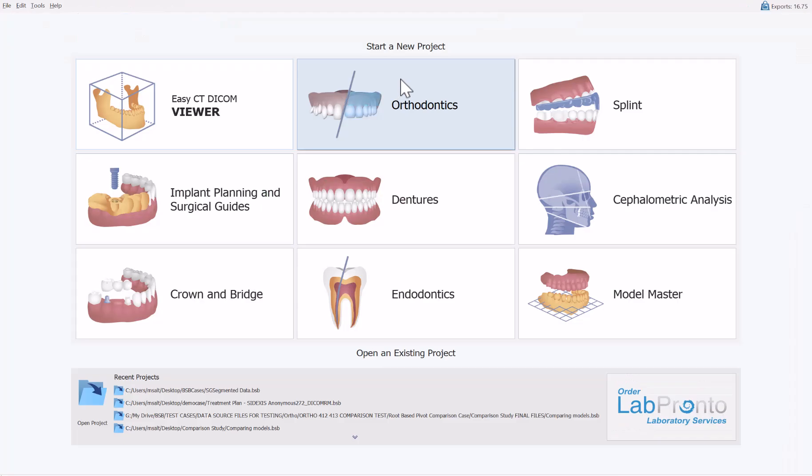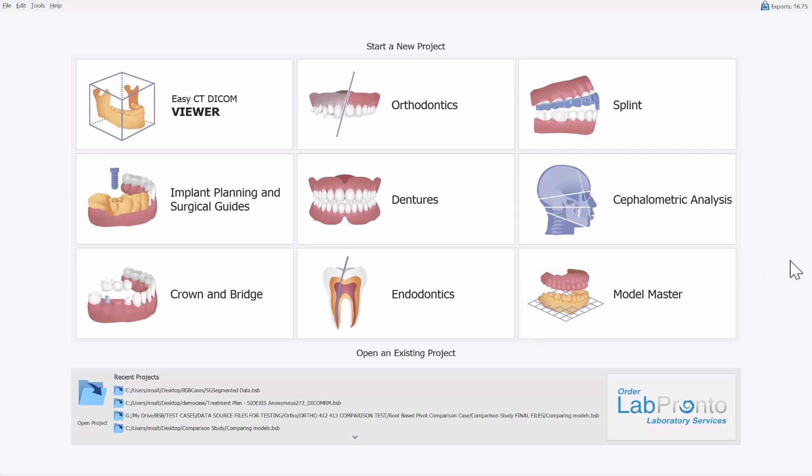The functionality can be accessed via the model master module, or if you're using surgical guide, crown and bridge, or dentures and going through the relevant process flows, the software will automatically load the model master module first for all data import and manipulation. You can access the segmentation from there and will automatically be prompted to continue with whatever process flow you're working on.